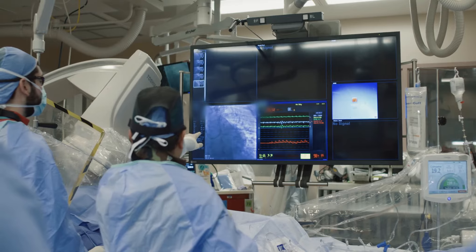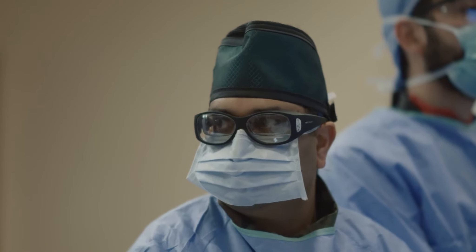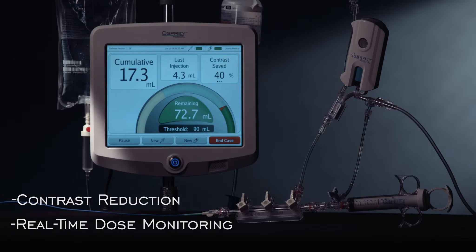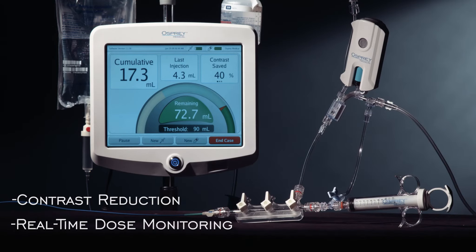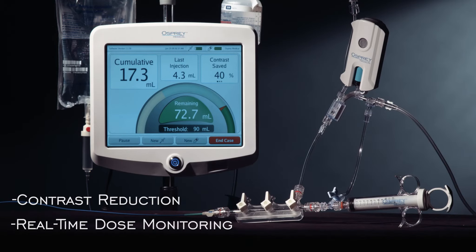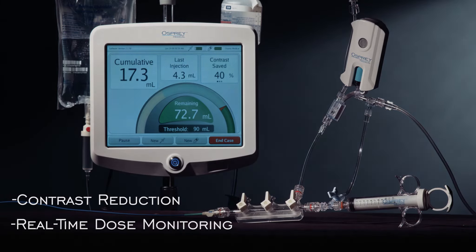The Divert Plus Easy system reduces contrast volume by over 40% on average without compromising image quality and provides real-time contrast dose monitoring throughout the procedure.